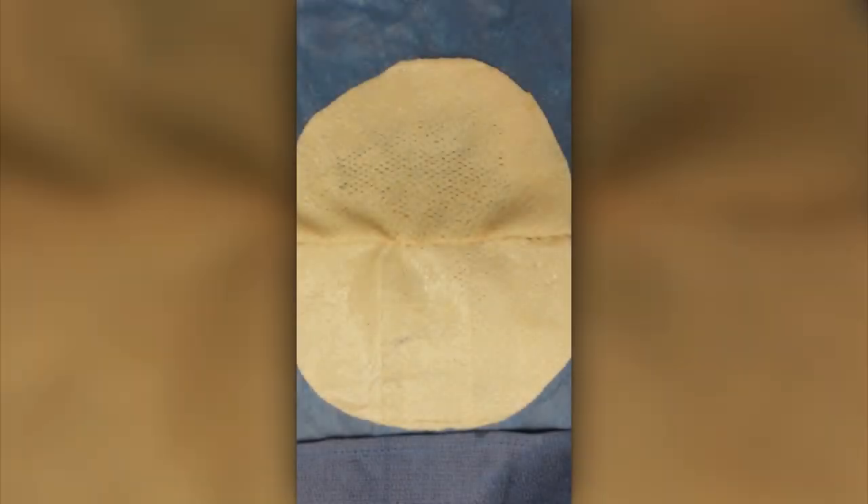In this video I'll show you how I use AlloMend shaped mesh material in order to perform direct implant reconstruction. As you can see here, I've taken two pieces of the shaped material and put them side by side and sewn them along the long straight edge.